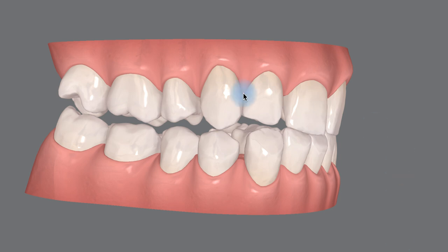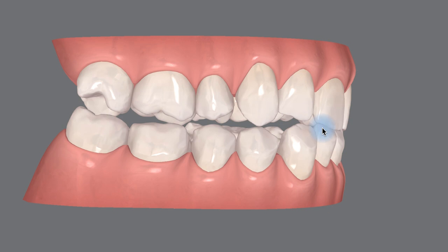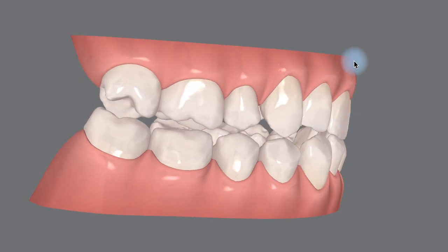Here's your case loaded up onto the digital platform for Invisalign. I wanted to go over a few things and a few options with you for your case. As we had discussed, you've chronically worn an over-the-counter mandibular advancement device, which has caused quite a bit of protrusion of your maxillary anteriors. When we're all said and done, we're going to hopefully convert you to a much more rigid and stiff, dental fabricated mandibular advancement device for the treatment of your sleep apnea. But unfortunately, this is where you are, and we need to get you out of the pickle.